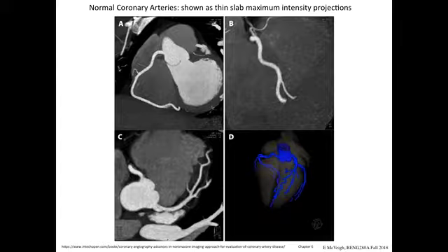So we're eliminating all of the interfering data above and below that slab. Inside that slab, we may have something like a coronary artery, where we want to see very detailed information. We don't want to see anything above it or below it. Just cut it out and do the projection. And you can see these fantastic angiograms that are obtained by doing that.